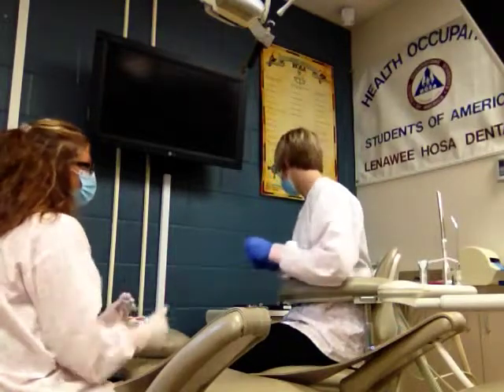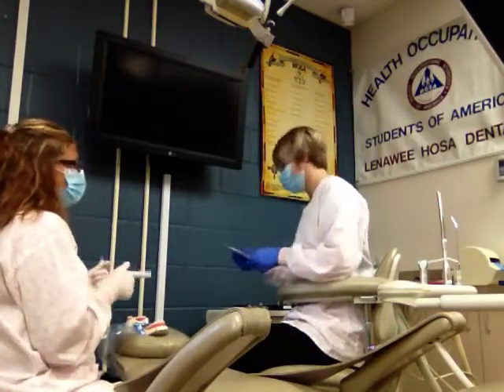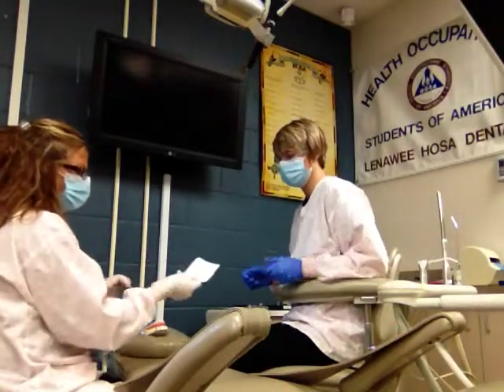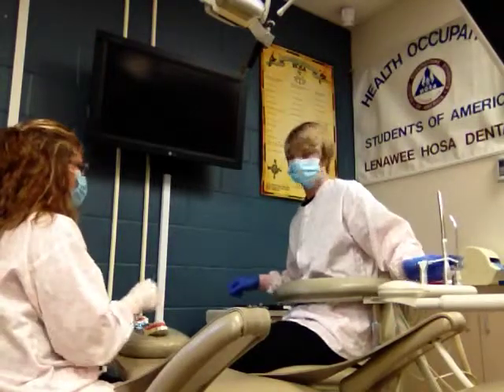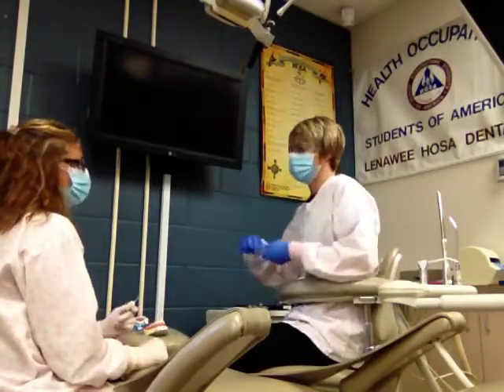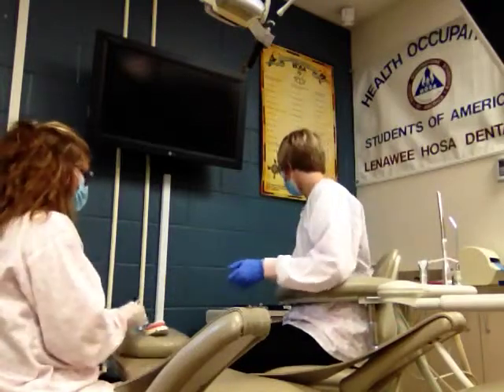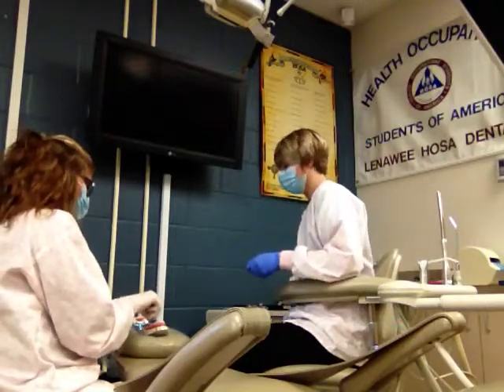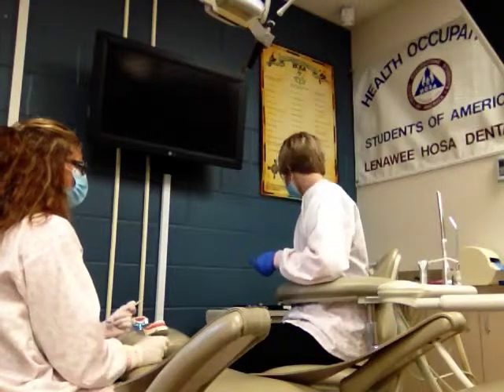Now, if it's partially bony or fully bony, there's alveolar bone all around it, so we'll need the surgical burr with the high-speed handpiece. Surgical burr is the really long burr. When we're using that, the assistant will use the surgical HVE. Then we're going to go through the elevators: small straight, medium straight, and large straight. Keep in mind there's also other elevators, depending on what the dentist would prefer. You might have 2 or 3 other ones that you need.